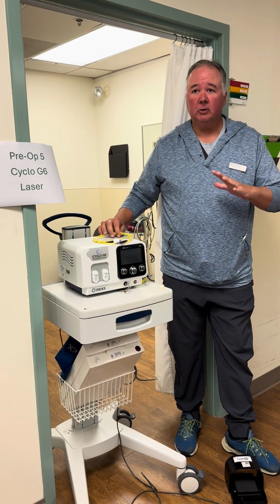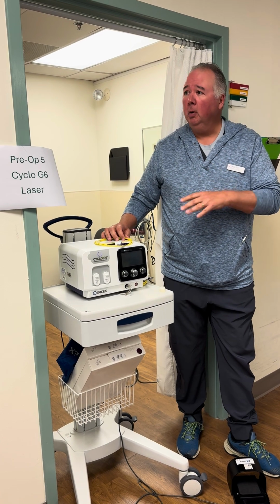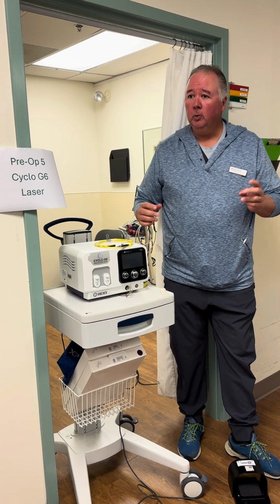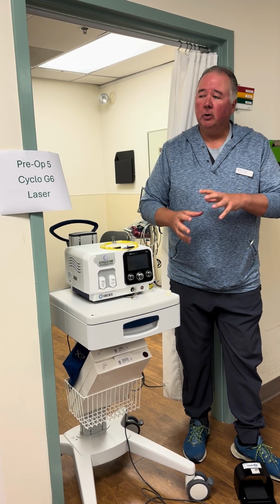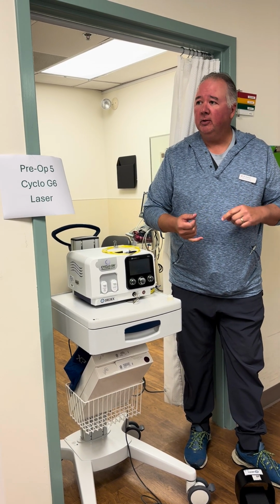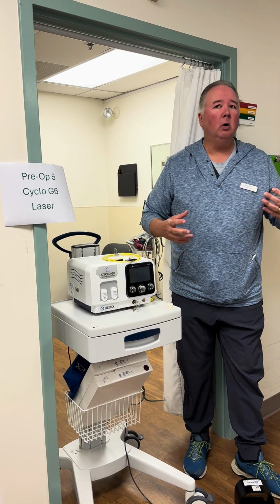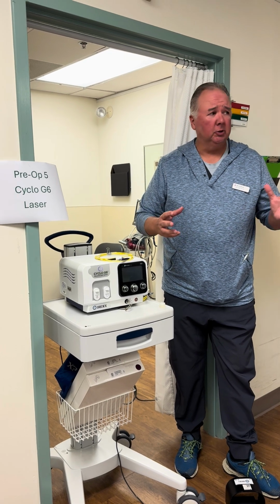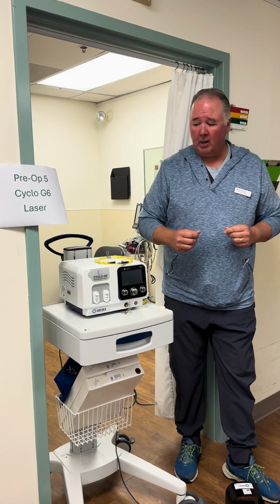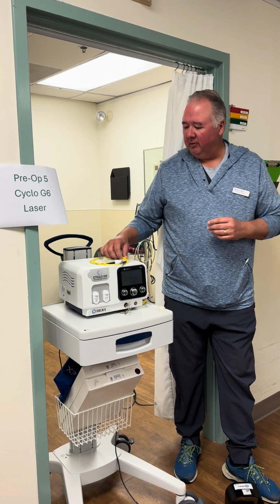Most of the time the doctors will say they want to do either a micropulse or a G probe. The difference between those two is that a micropulse is actually a lesser invasive glaucoma procedure. These are for patients that still have good visual potential. Maybe they're on several drops and the doctor wants to try to get them off a couple drops. It's usually less invasive, like I said.